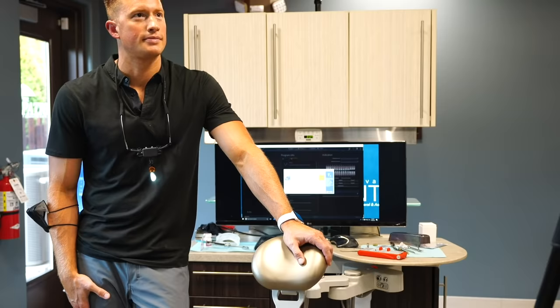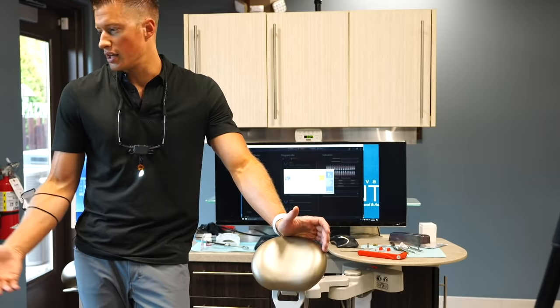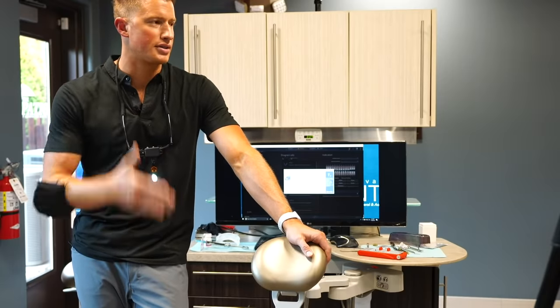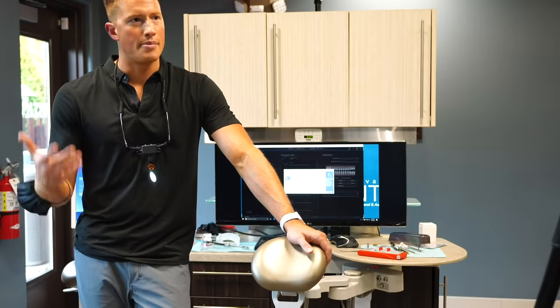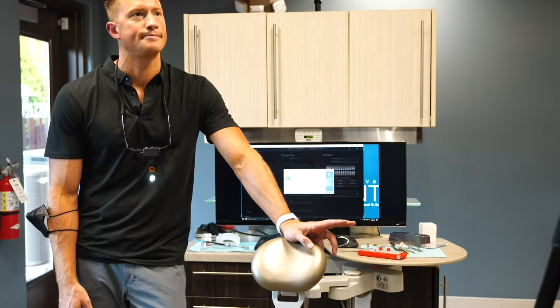Hopefully that proves it. These procedures can take less than 10 minutes. I even had to back the implant out and put it back in because of real dense bone, which can happen, especially because we were up against his dense bone towards his tongue. But we still did it in 12 to 15 minutes. So placement's pretty quick.